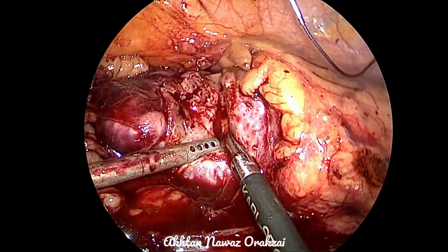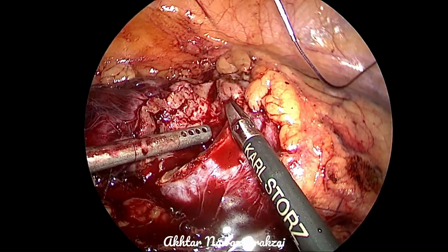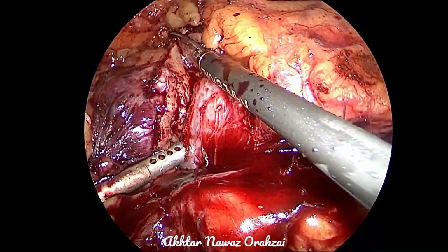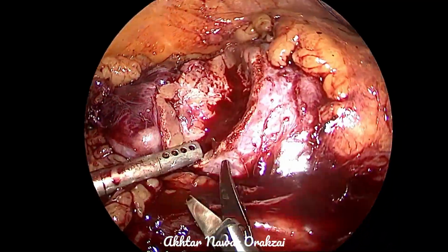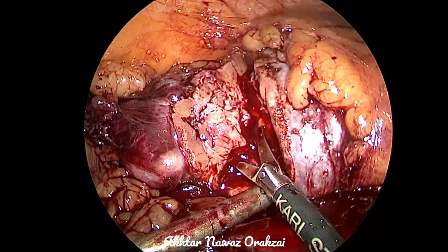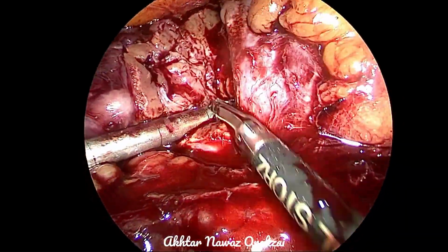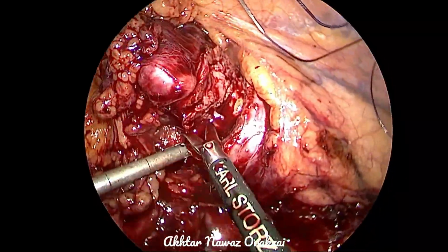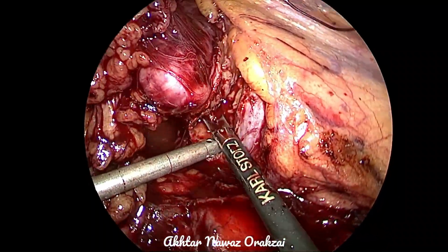So you can see that my left hand instrument is grabbing the fat over the tumor and is pulling away, and the right hand is cutting the tumor. The suction is placed at an area where it is also providing a counter traction, so the dissection has become easier with this technique. Always try to leave fat over the tumor.